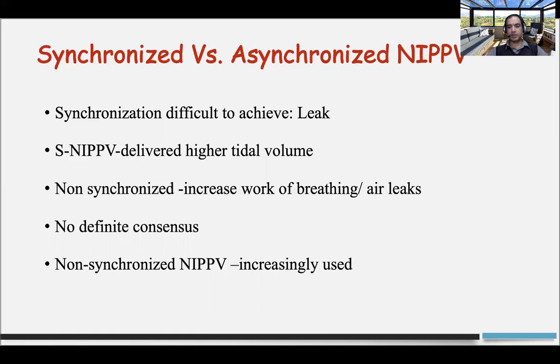Synchronized machines are not easily available, and synchronization itself is a tedious job, because the various devices which are used for synchronization are affected by the leak or water in the circuit, and also the placement of the Graseby capsule itself is a big challenge.